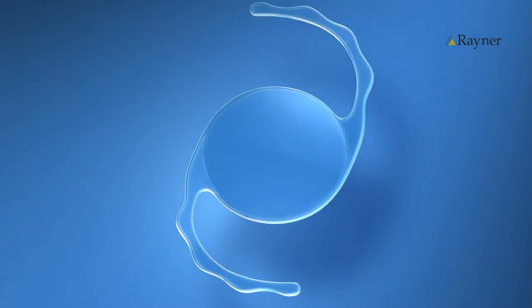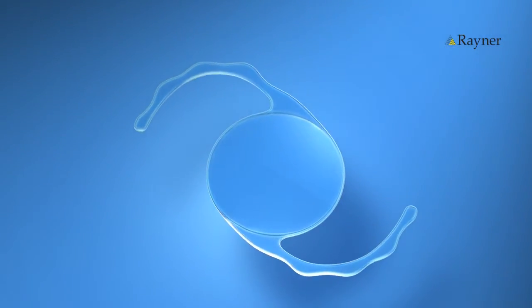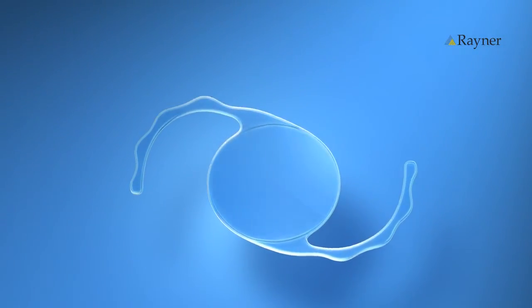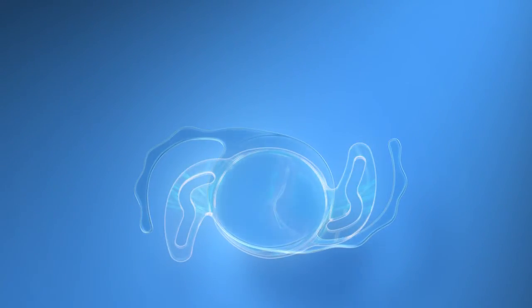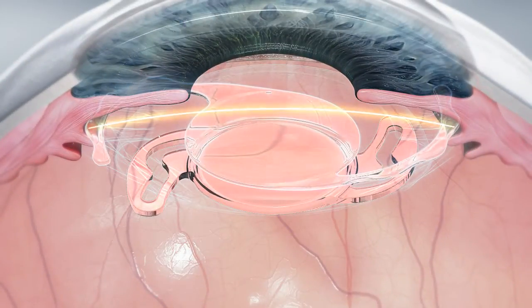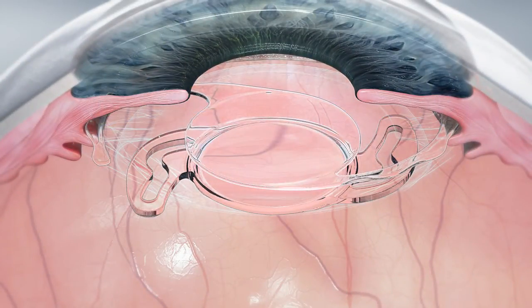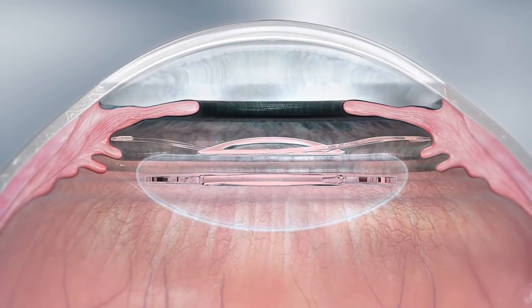Welcome to the SulcoFlex Duet. The SulcoFlex Duet technique is the reversible conversion of a pseudophakic eye to emmetropia. After primary lens implantation, a SulcoFlex IOL can be implanted in the ciliary sulcus to correct residual ametropia. The SulcoFlex IOL has been designed to avoid the problems associated with conventional piggyback procedures.